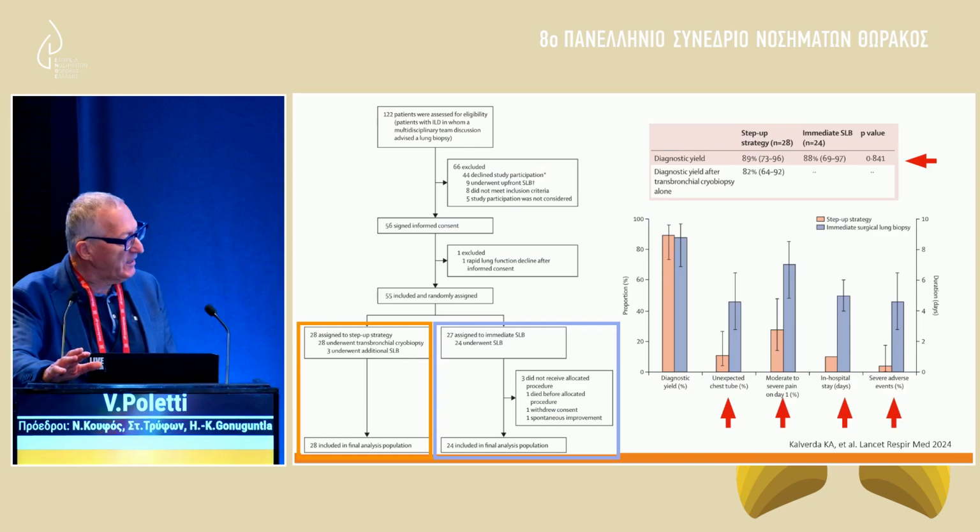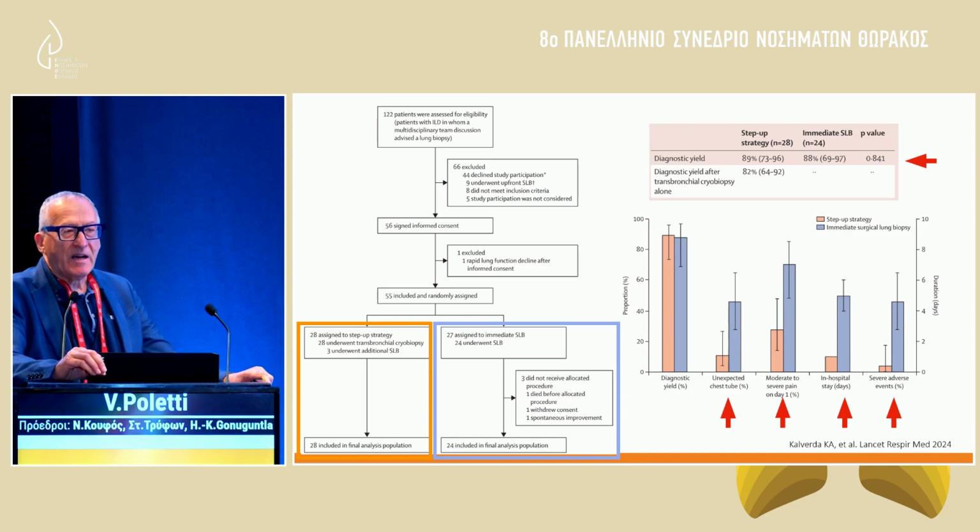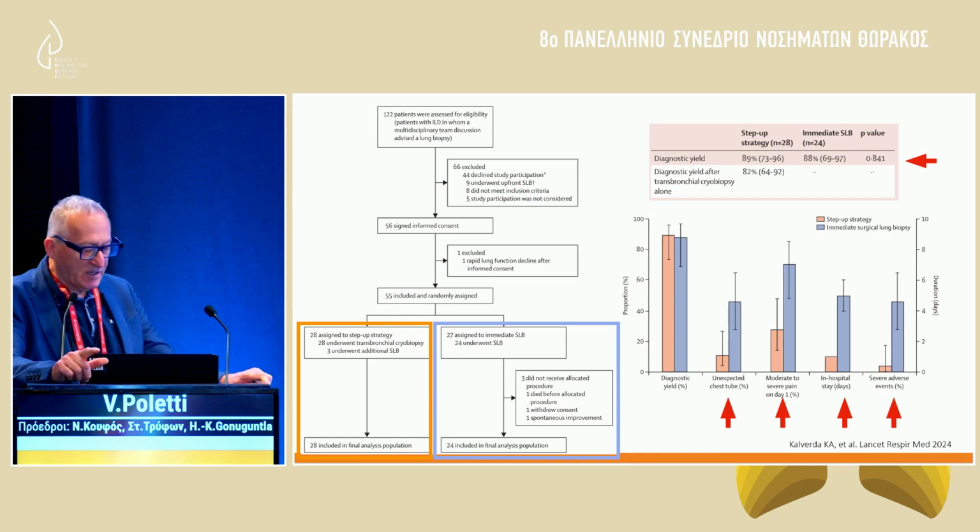We made a study with the Amsterdam or Netherlands group showing that if you adopt this approach, cryobiopsy first and surgical biopsy after if the cryobiopsy failed, you have fewer complications and the same diagnostic yield.